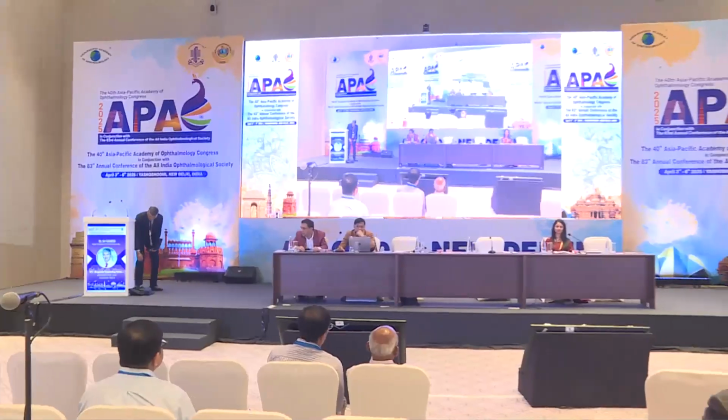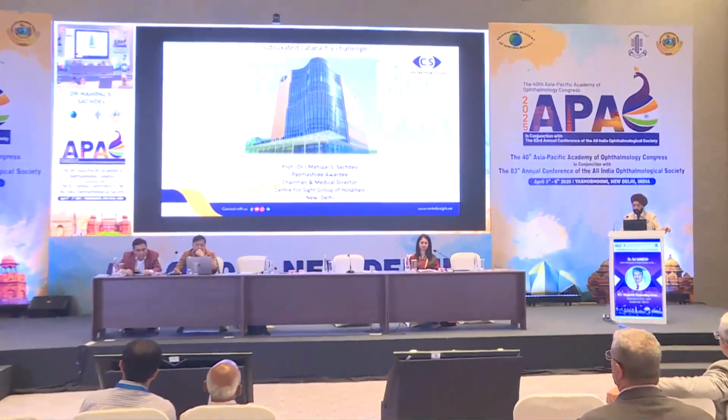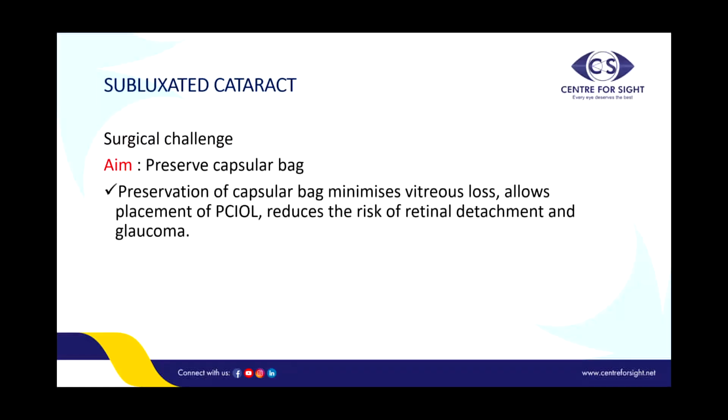Thank you very much. I'll be talking about subluxated cataract, and specifically how we manage it using femto laser assisted cataract surgery. Now, as has been said by the earlier speakers, in subluxated cataract, what is the basic aim? The basic aim is to preserve the capsular bag and to have minimal vitreous loss, because if you have vitreous loss, it's very difficult to keep the bag in place. And if you have the bag preserved with minimal vitreous loss, you will be able to place the IOL properly, and this would reduce the risk of problems like retinal detachment, glaucoma, iris chafing, etc.